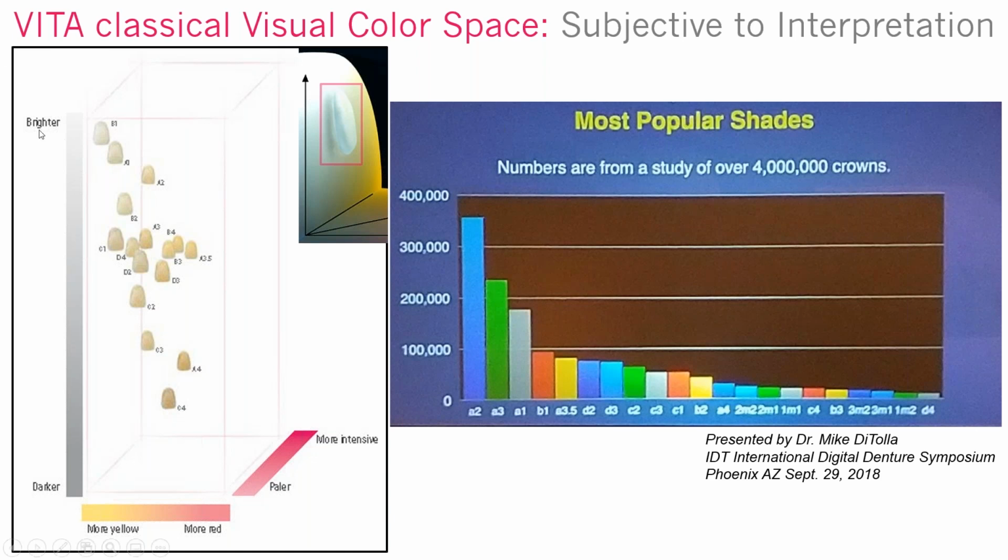Well, if you look at the individual shades of the classic shade system, and you put them in that box of natural dentition, natural colors, A2 is somewhat on the bright end. It's kind of orangish. Most teeth are a little orangish, yellowish, maybe reddish, but mainly within that orange group. And A2 fits within what we perceive as the most natural looking shade. So we normally will go see a patient and take our A2 shade tab out, put it to the patient's mouth and go, oh yeah, A2, that works.